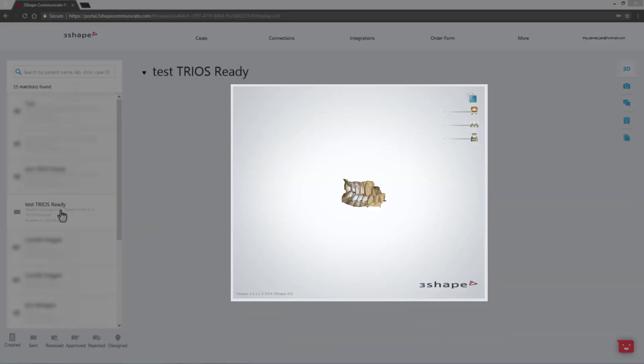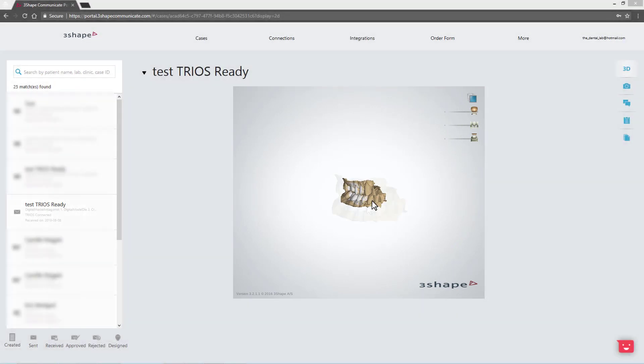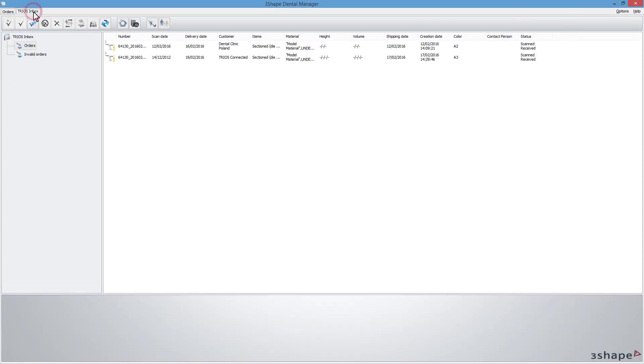In the middle window, you can investigate the 3D view of the scan. Remember that you have to integrate your dental system with the 3Shape Communicate account of your lab. Enter the TRIOS Inbox tab in Dental System and accept the order.